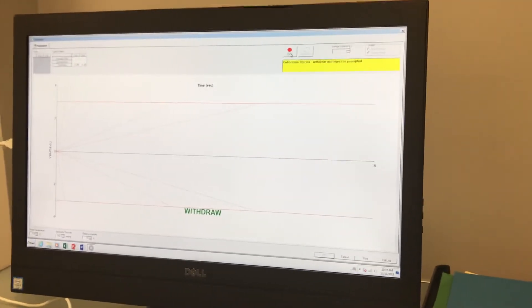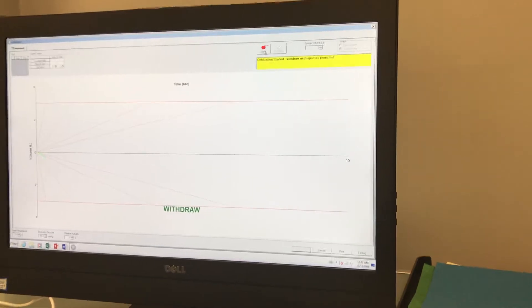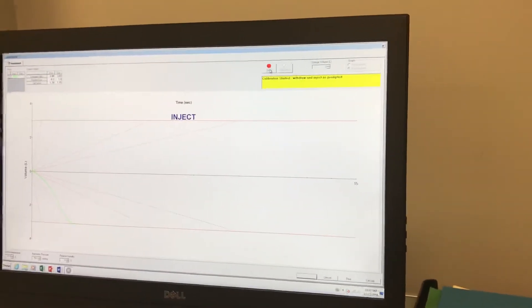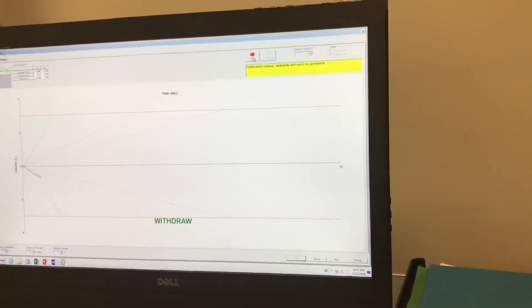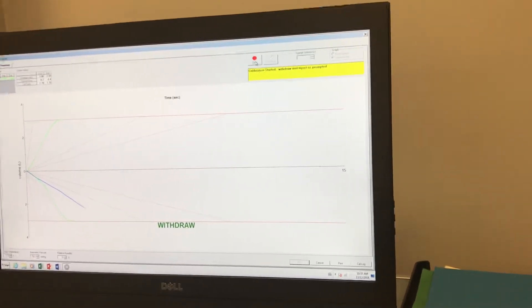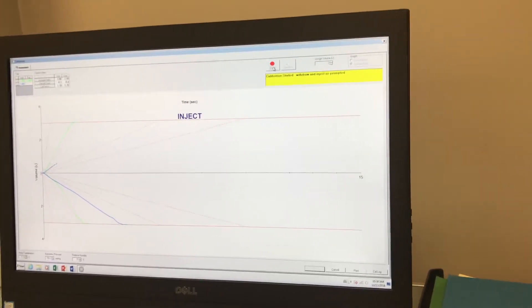So again, withdraw and inject. As you can see, it's coming right in on the line now.